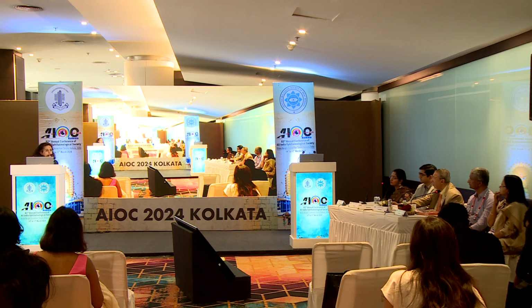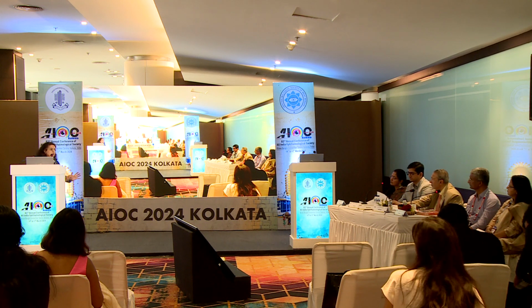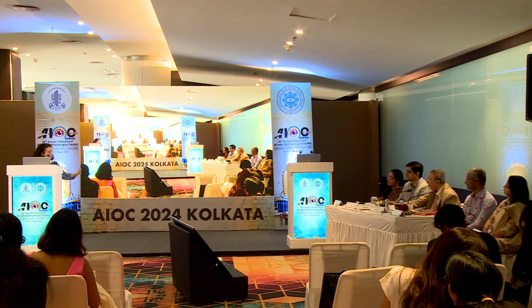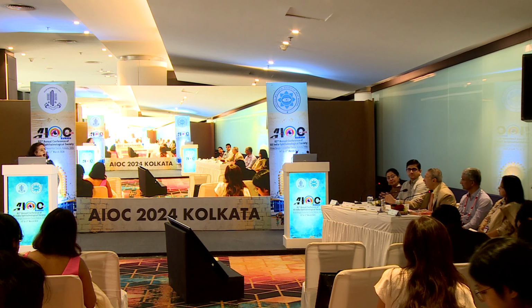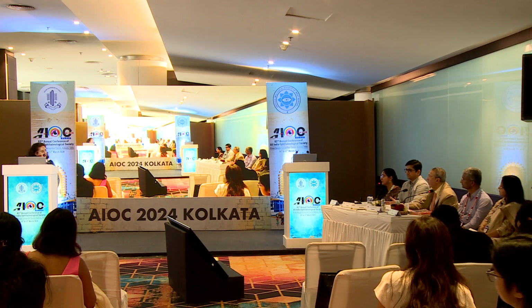Sir, the mechanism in scientific terms I cannot explain, but there is some anatomical persistence of the same host tissue, because sometimes I have noticed that besides everything going ideal, there is a lot of push from behind. In those cases, having that hinge, we immediately turn it back. I agree that it is good for your anxiety, it helps you because you can immediately close the wound. Yes, that is correct, but it doesn't prevent anything. If a suprachoroidal hemorrhage is to occur, it will occur.